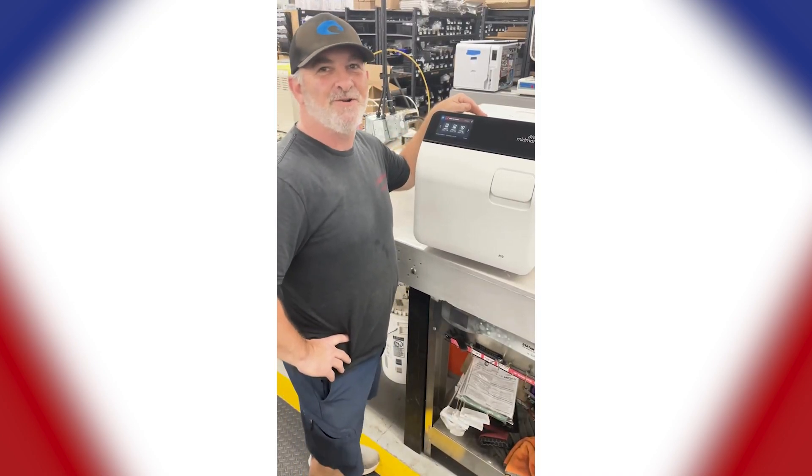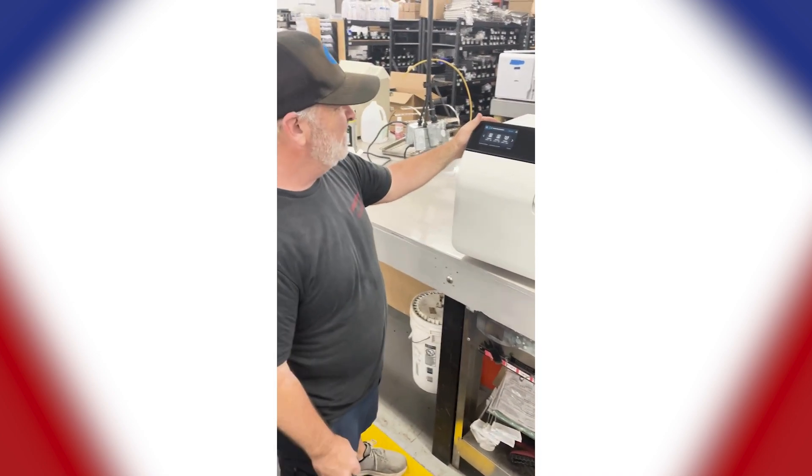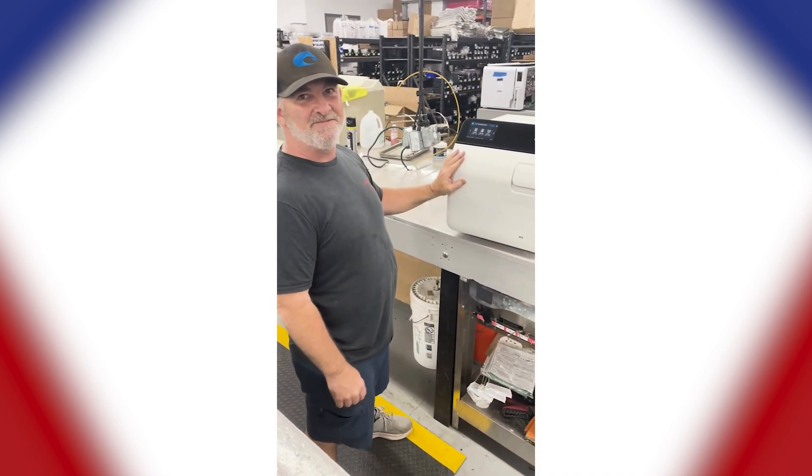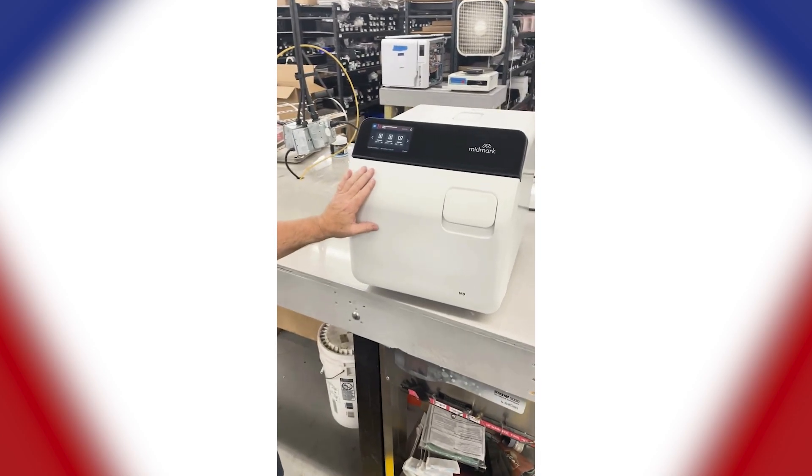Hello, this is Ron with Sterilizer Autoclave Solutions. Today we have the new Midmark with us. This is the fifth generation, and as you can see, they did a lot of changes to it.